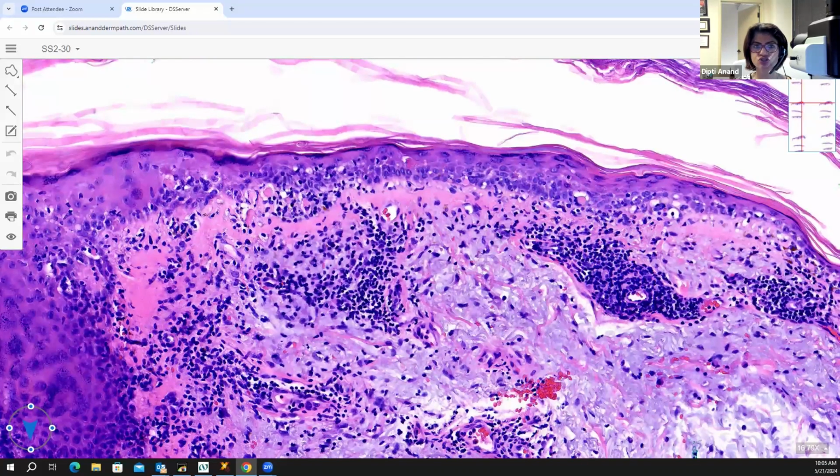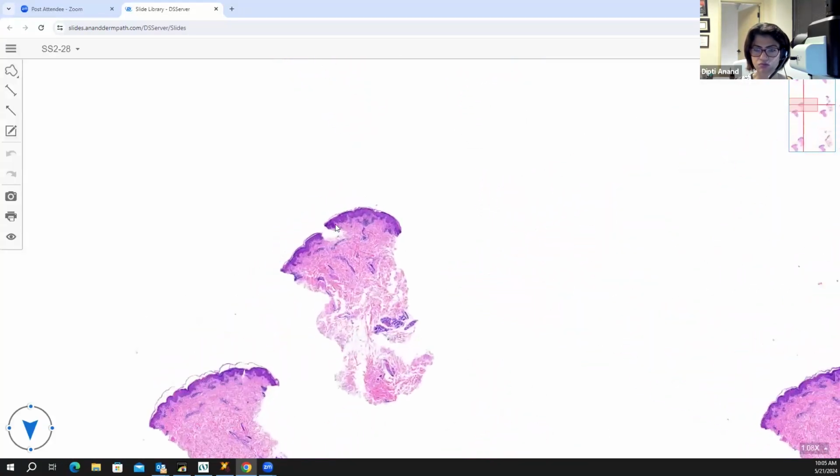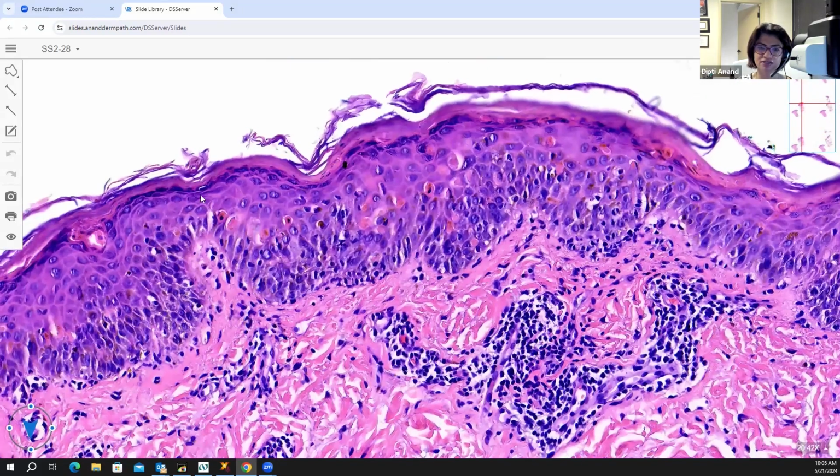In contrast to this pattern, see the pattern of necrotics here? It's different. So sometimes that can help in the recognition if you're not getting the thickening versus the thinning of the basement membrane. And I really thought I had a slide of PLC in there.